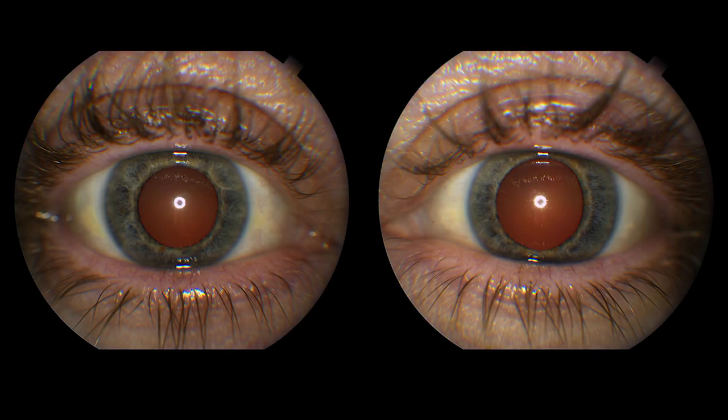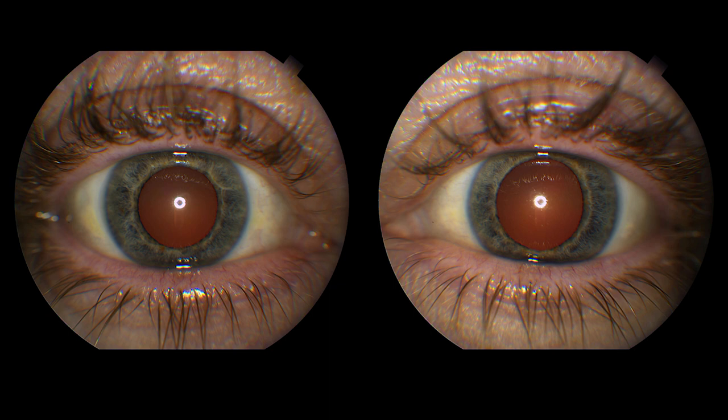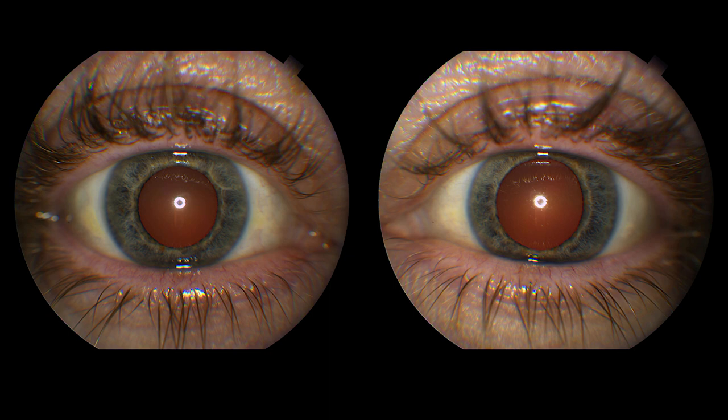This image illustrates a normal red reflex with a reddish-orange glow. There is no dulling or whitening of the reflex, which indicates a transparent and healthy visual axis and retina. Also note the symmetry between each eye.